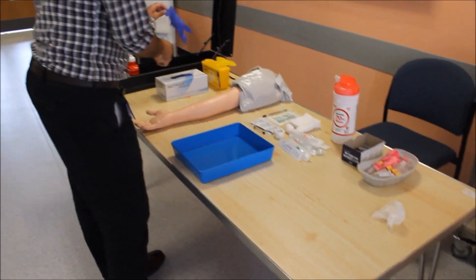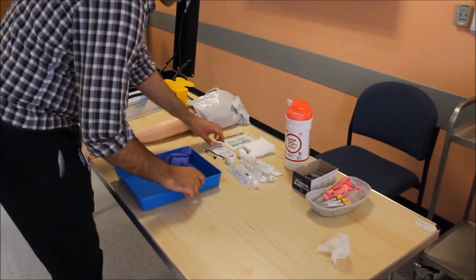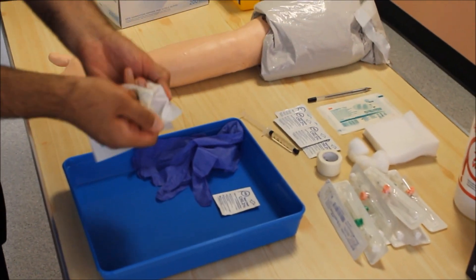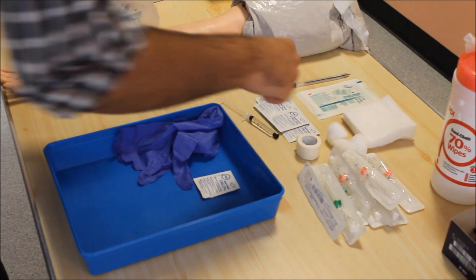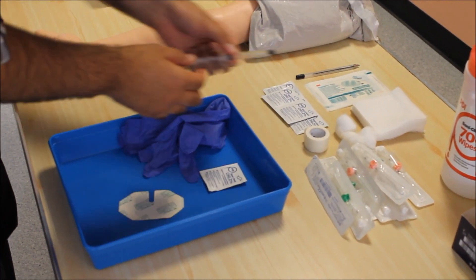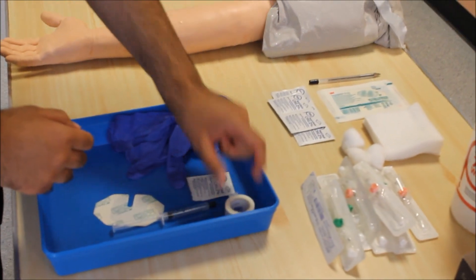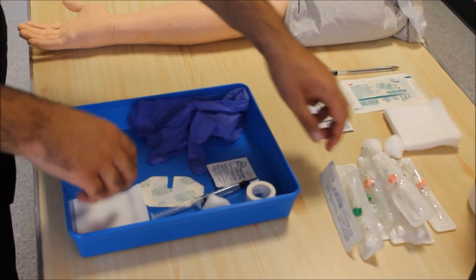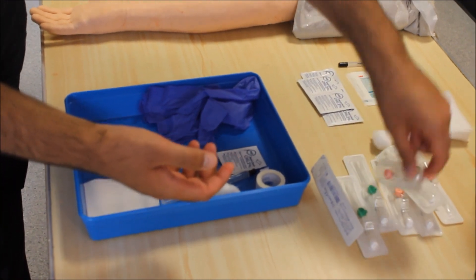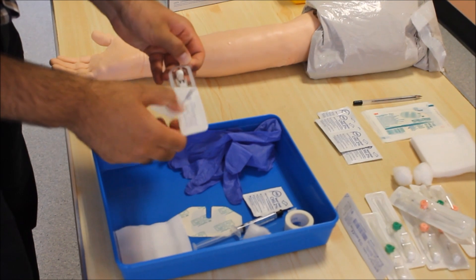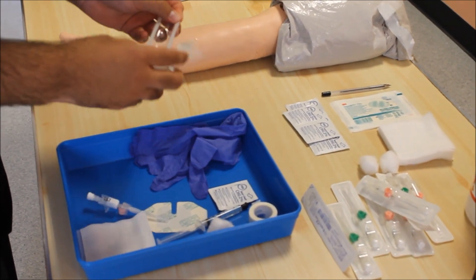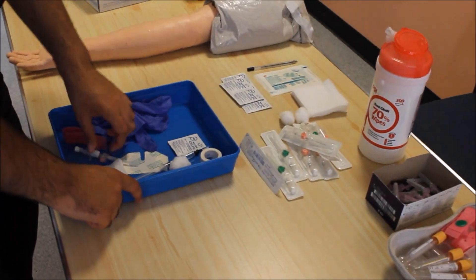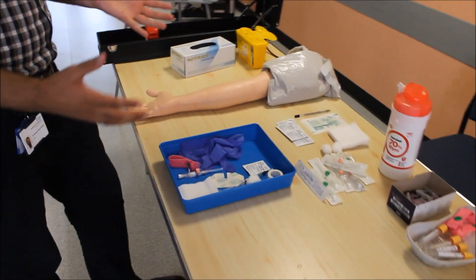After that, I will start preparing my tray with gloves, alcohol swab, Tegaderm, flush, tape, cotton, a bit of gauze, either a pink or green cannula, whichever you want according to the patient's ease. And most importantly, a tourniquet. So that's our tray prepared for IV cannulation.